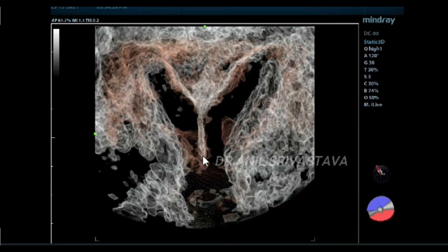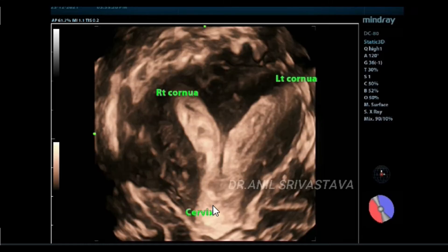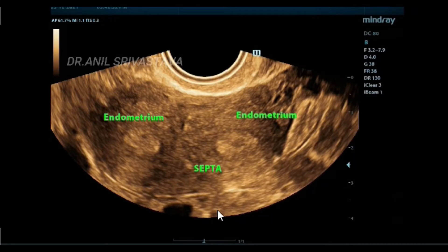This is the myometrium. This is the right cornua, this is the left cornua, this is the cervix. You can see two spindle-shaped canals coming and communicating from each other lower down. There is a myometrial septum between the two, with beautiful endometrial echoes.